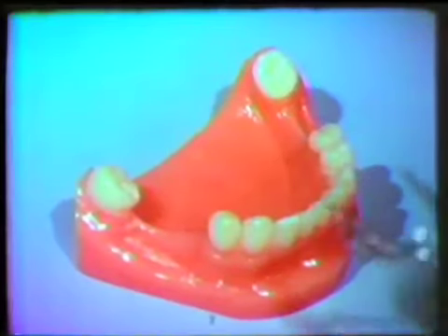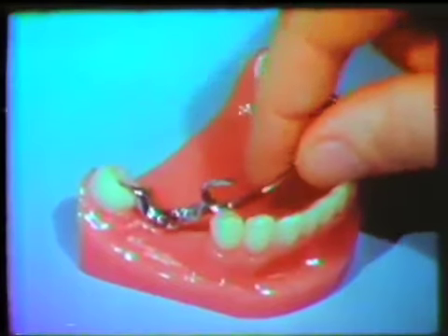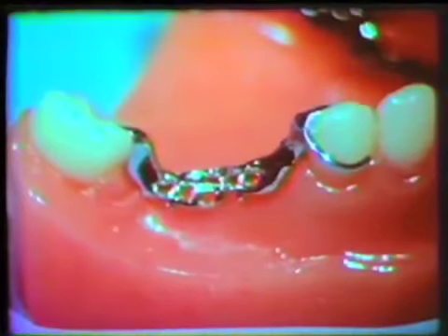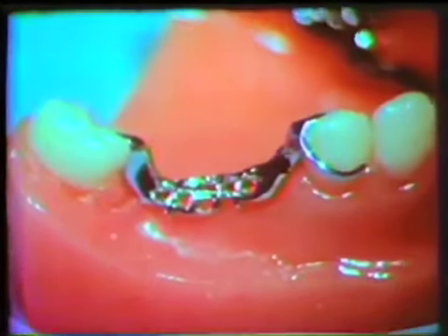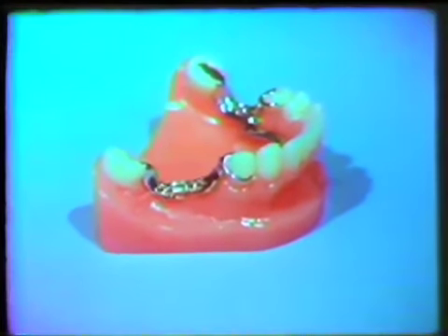When seating the completed framework, the distal-most ends of the molar rests are placed in position first. Then the clasps on the anterior abutments are seated. Notice that the inferior portion of the anterior minor connectors will follow a curved path, which is dictated by the posterior rotational centers. Therefore, the blockout in this area must be accomplished as described in order that the framework can be seated without interference.